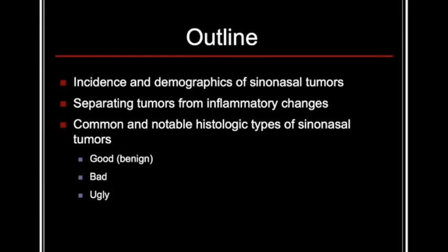So during this talk, I'm going to describe the incidence and the demographics of sinonasal tumors. I'm going to discuss how we separate tumors from inflammatory changes, which I think is one of the most important things we can do at the PACS station. I'm also going to go over common and notable histologic types of sinonasal tumors, and I divide those into the good, the benign tumors, bad, and ugly. And unfortunately in this area, bad and ugly tumors seem to predominate the discussion.